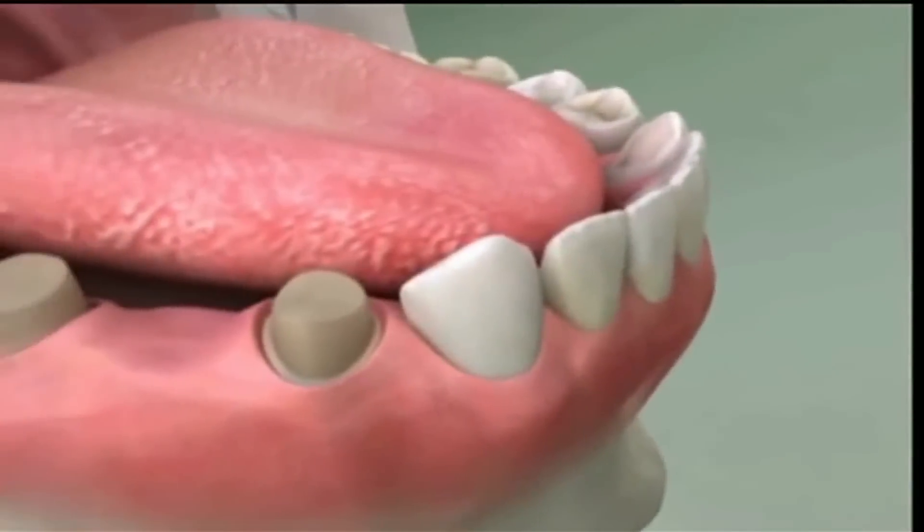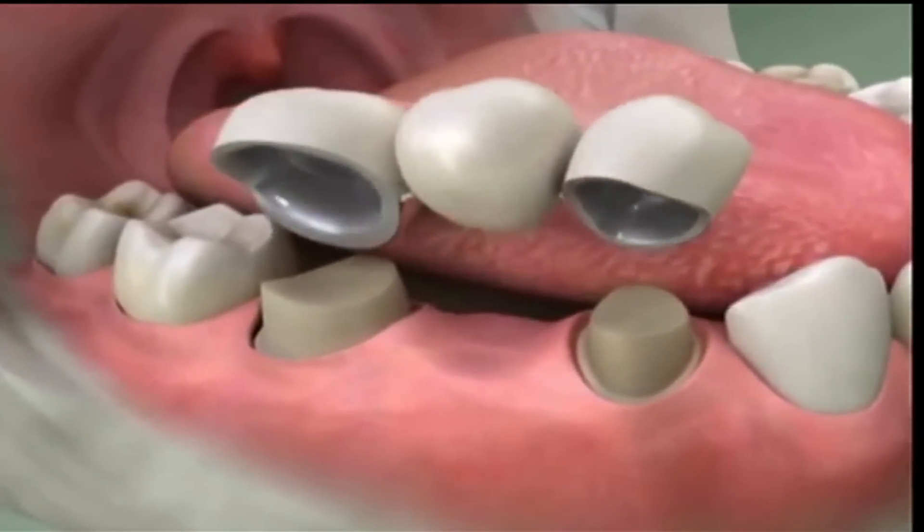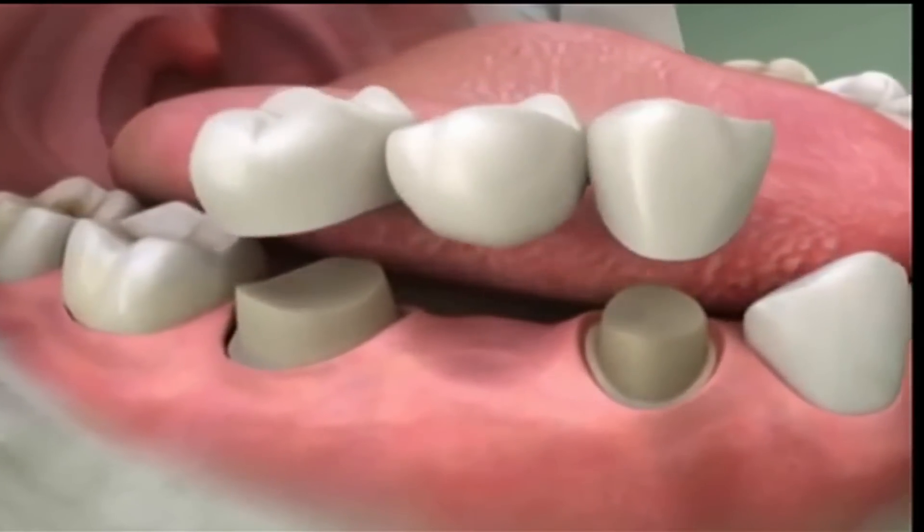One way to do that is with something called a bridge. A lot of patients are confused or concerned about what a bridge is, so I'd like to give a couple explanations. One explanation of a bridge is using the adjacent teeth to support the fake tooth, or what we call the pontic.